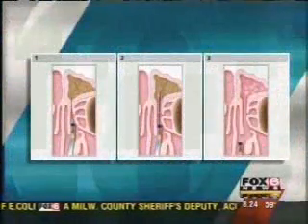It really is. And before, people either had surgery as an option, maybe antibiotics. Right. The balloon sinuplasty, where that works best, is for people who've had recurrent infections but haven't been candidates for traditional surgery. And it sort of hits the middle there for those people. Let's take a look at some images that you brought along, and we're going to see exactly what the procedure involves. What is this that we're seeing?